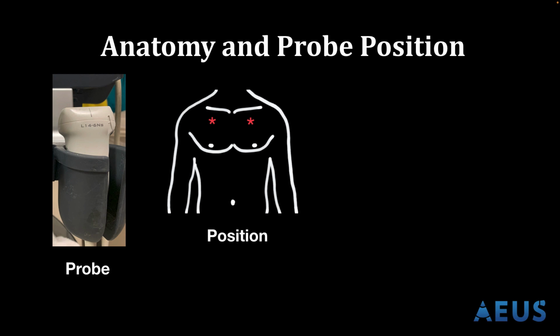One retrospective study performed in 2011 suggests that an anterior-inferior position at the 5th to 8th intercostal spaces may be a more sensitive location. However, another prospective study in 2016 found that a single view at the 3rd intercostal space had comparable sensitivity and specificity to a 4-view protocol that examined more inferior and lateral positions. So, with all that being said, let's place our probe on the anterior chest wall at the 2nd to 4th intercostal spaces at the mid-clavicular line, as that is the most common starting position. Your probe should be in a sagittal orientation with the indicator pointing cephalad.